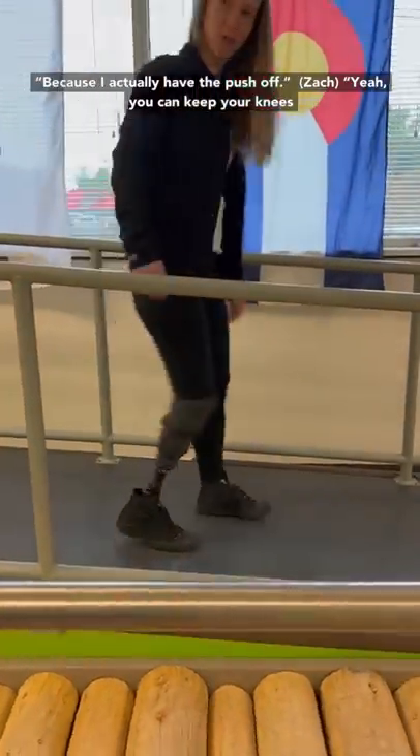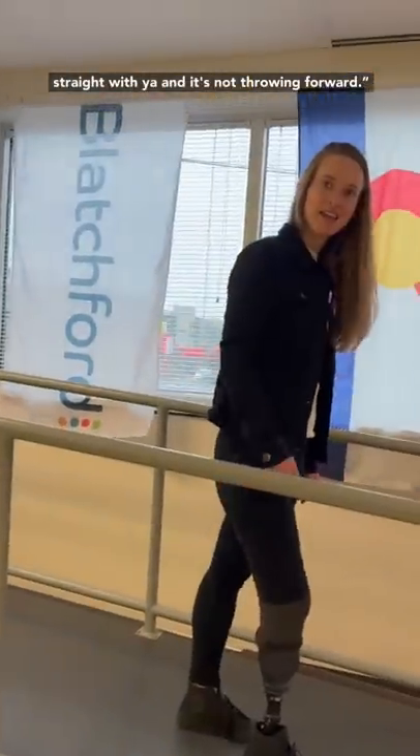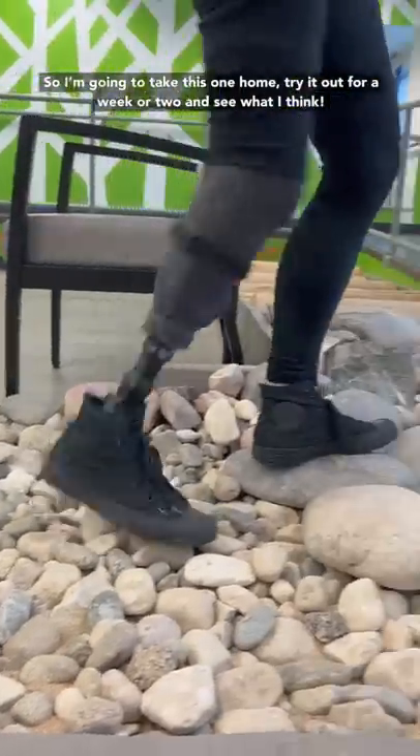Because I actually have the push off — you can keep your knee straight and it's not throwing forward. That's really cool. So I'm gonna take this one home and try it out for a week or two and see what I think.